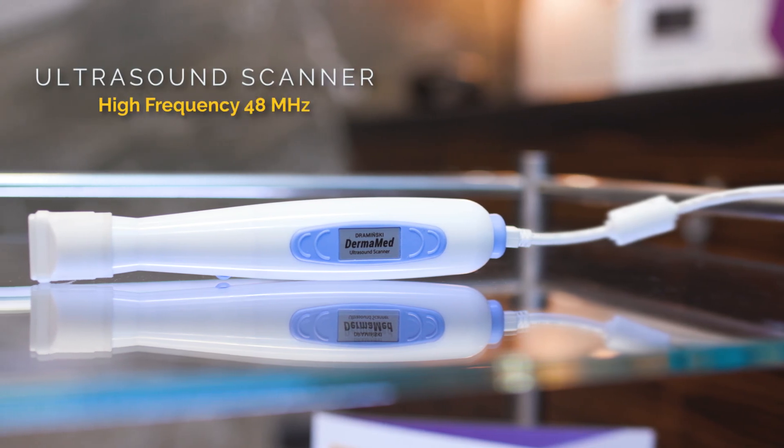I would like to introduce you to DermaMed, a high-frequency ultrasound for precise imaging of skin layers.